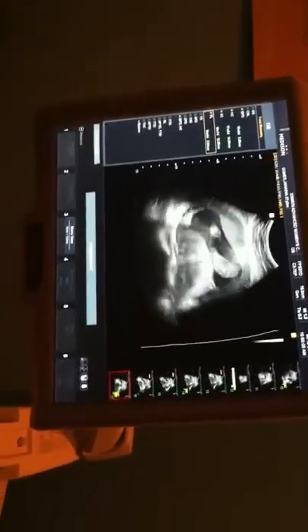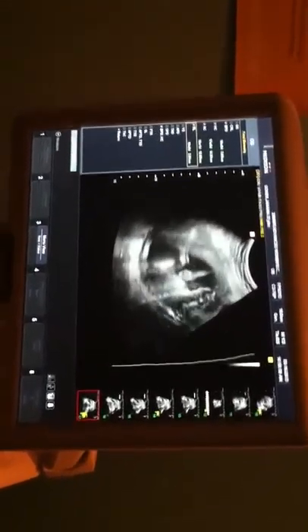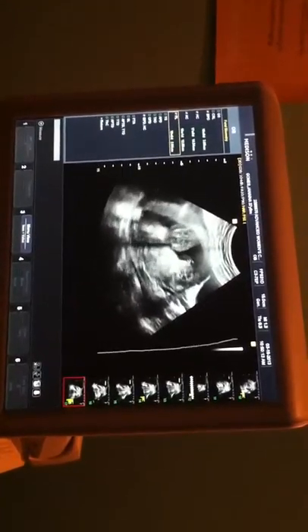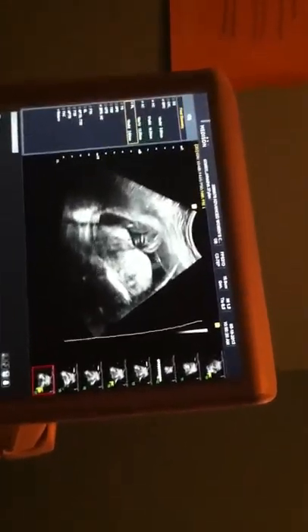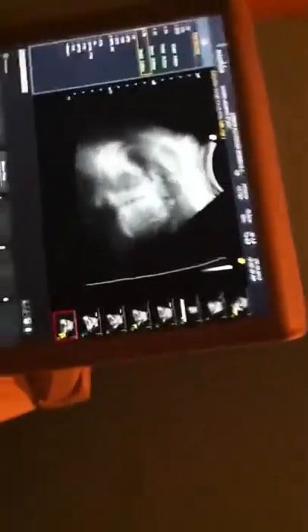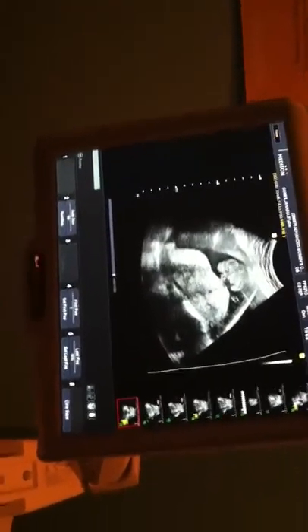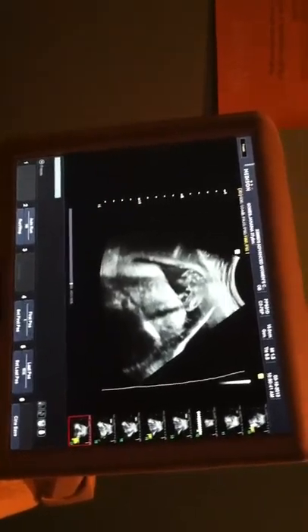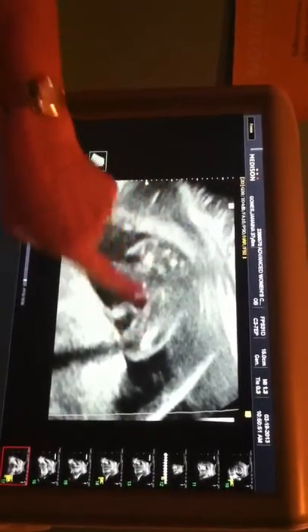I'm gonna finish with all that stuff. Yours is shy — mine was all open. There it is, right there. That's what kept getting in our way, but that's a boy part. It's a little bigger so we can see a little better. The leg there — other leg would be here — and then there's your part.